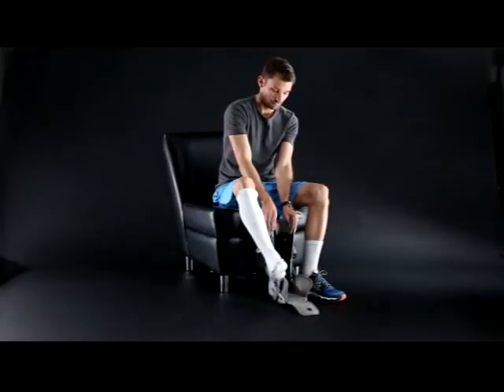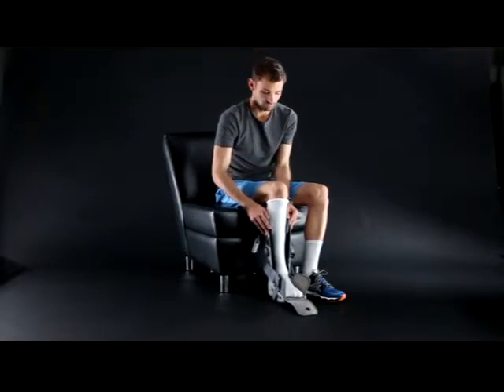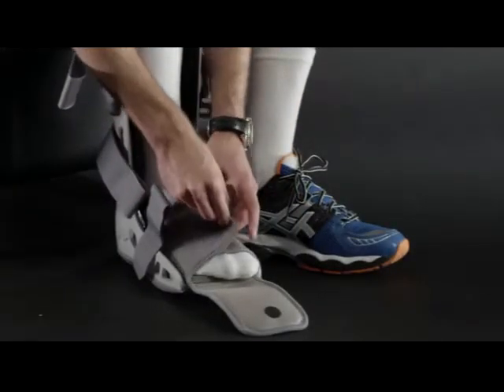Sit in a comfortable position to apply the boot. Place your foot in the boot with your heel against the back of the boot. Wrap the foot flaps over your foot and the toe cover around your toes.